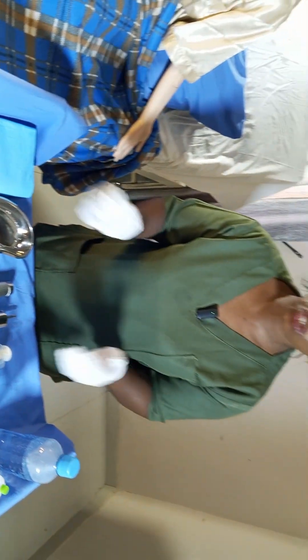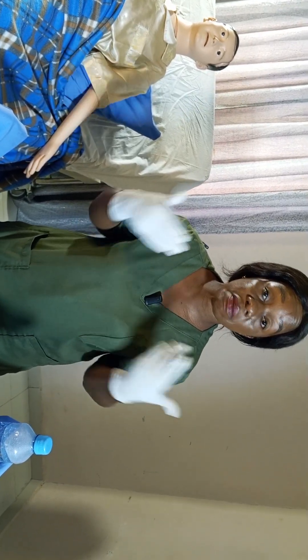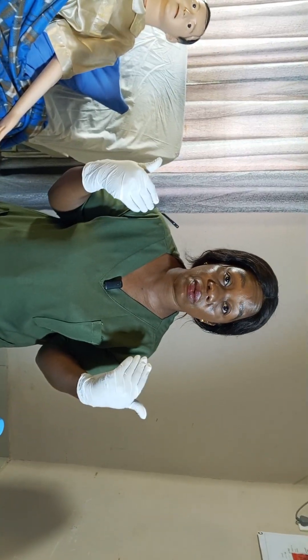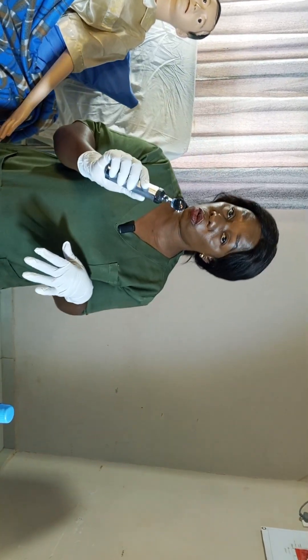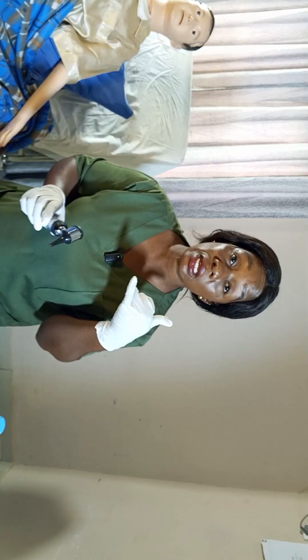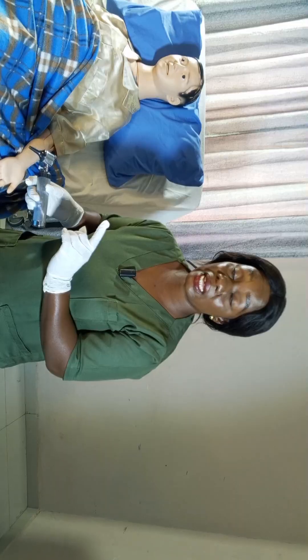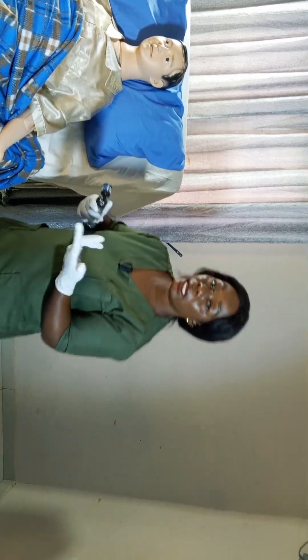Before I mix my solution, I have to check the patient's ear. I have to ask the patient whether they are having pain, any discharge, or blood coming out of the ear. So I use my otoscope to examine the ear. Make sure your otoscope is functioning and has light so you can view the patient's ear canal. You must first ask the patient which ear has the problem — is it the left or the right? Let's now examine the patient's ear with the otoscope to view the eardrum and ear canal.